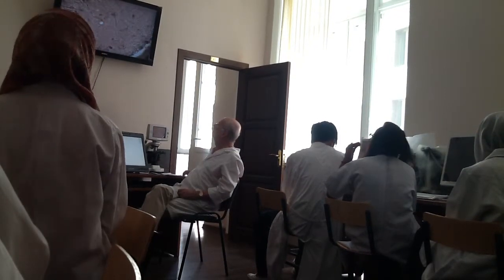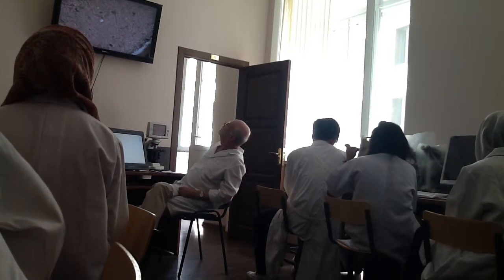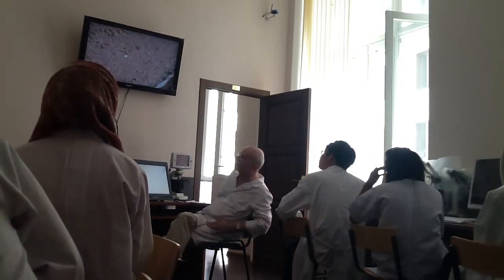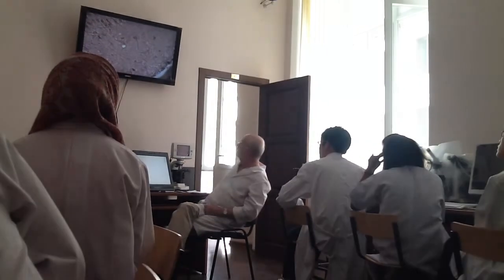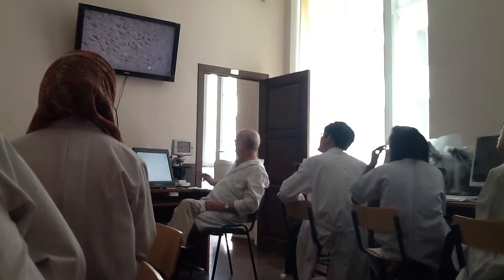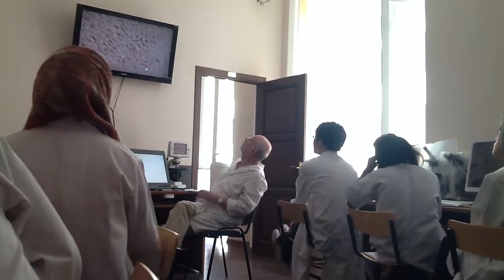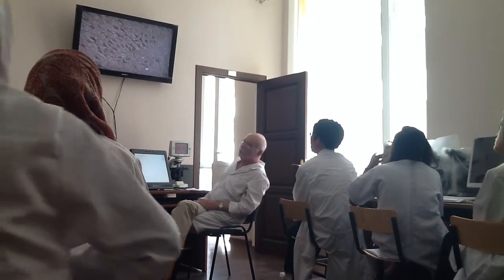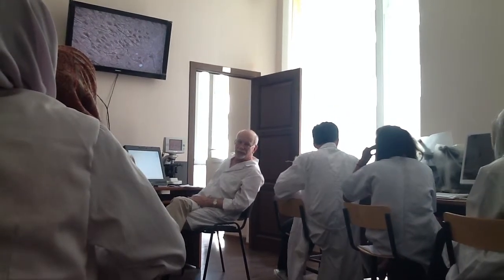Molecular layer from the surface up to this layer. Single neurons and numerous fibers are present in this layer. This layer is rather thick. Next. Rare oval or polygonal neurons are visible, but the pyramidal neurons appear immediately. So the pyramidal layer begins.